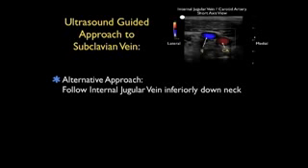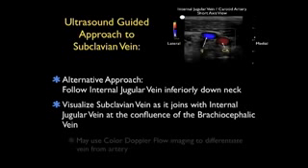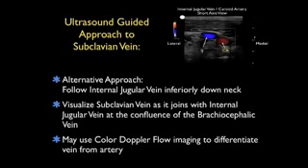An alternative approach to find the subclavian vein and brachiocephalic vein is to follow the internal jugular vein inferiorly down the neck. We then visualize the subclavian vein as it joins with the internal jugular vein at the confluence of the brachiocephalic vein. We can use color Doppler flow imaging to differentiate vein from artery — notice the characteristic pulsations of the artery versus the constant phasic respiratory hum of the vein.